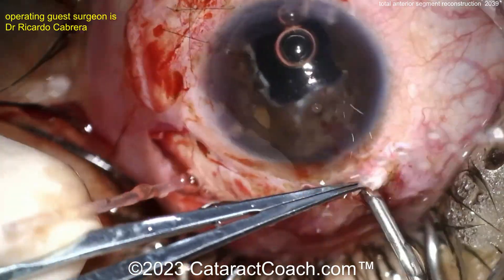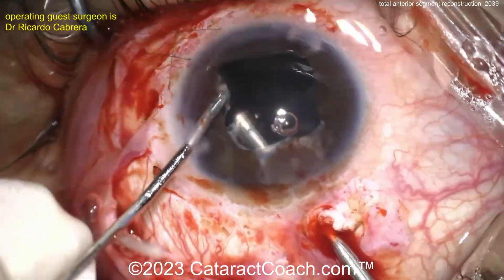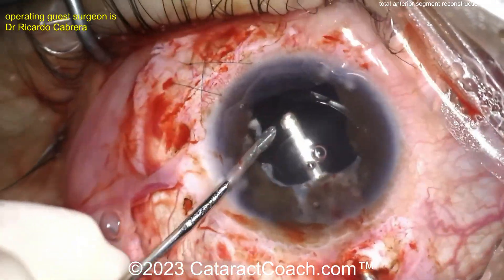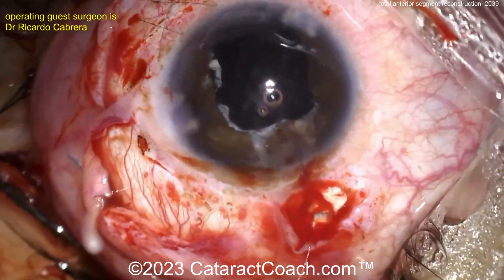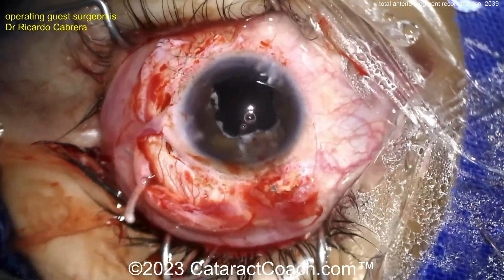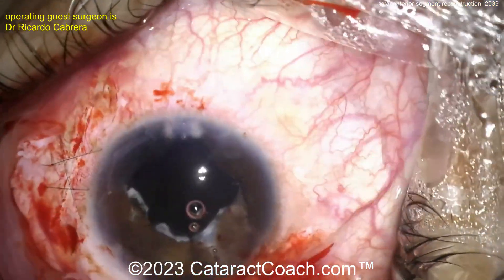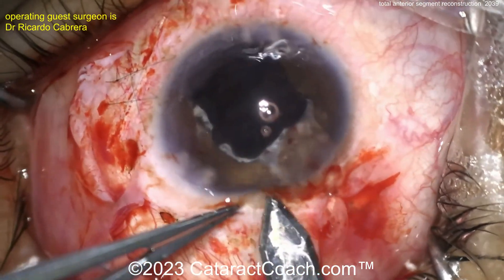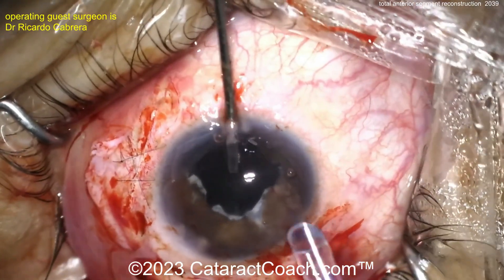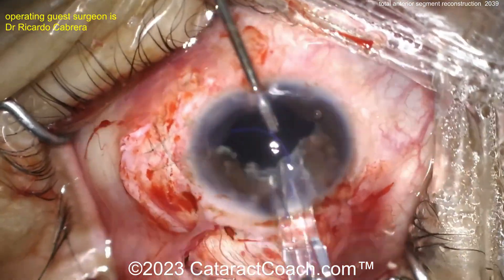An entrance into the anterior chamber — and pars plana. There's the vitrector cleaning up any vitreous. Triamcinolone helps a lot here. On a scale of 1 to 10, this is an absolute 10 out of 10 difficulty. This is not a case for a new or young surgeon who's just learning — no. This is for a very experienced and advanced surgeon, and here we have our surgeon who has a lot of experience.